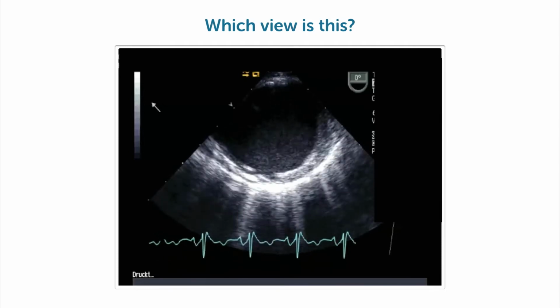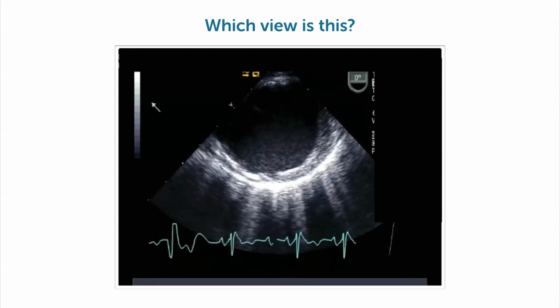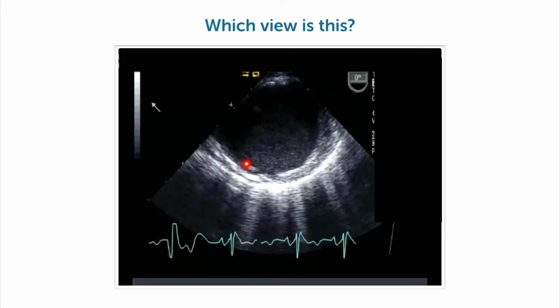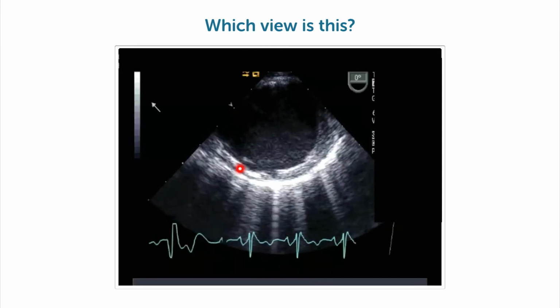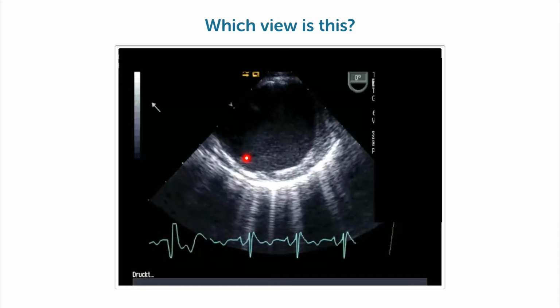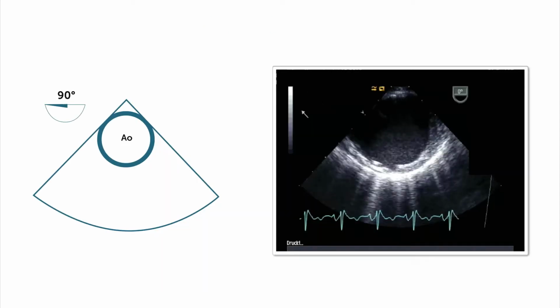Clear, this is a short axis view of the aorta. But there's something peculiar on this image. We see that there's a small mobile structure right here, which probably is a part of an atherosclerotic plaque. And this patient is definitely at risk of developing embolism.